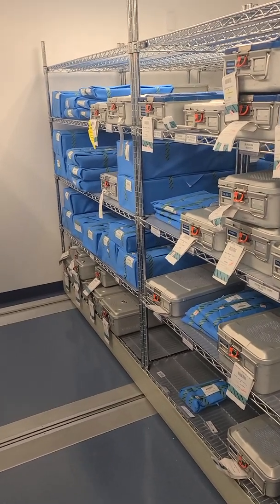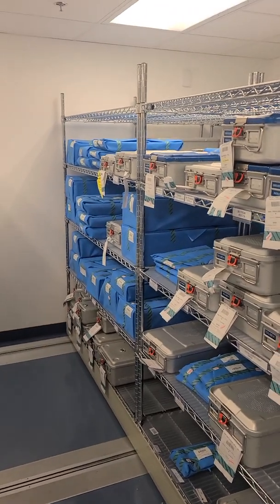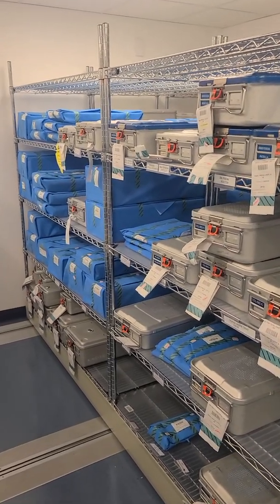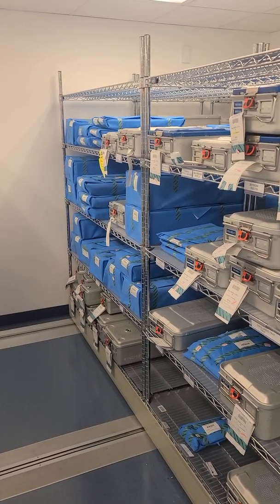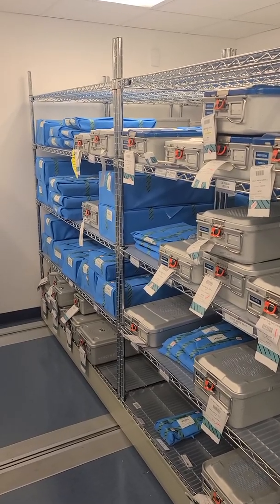Welcome back to WDYDCSP — What Do You Do as a Central Sterile Processing. Today on the how-to series, the very first one, we're kicking it off with what I believe is the first step in the cycle of an instrument in sterile processing, which is storage.